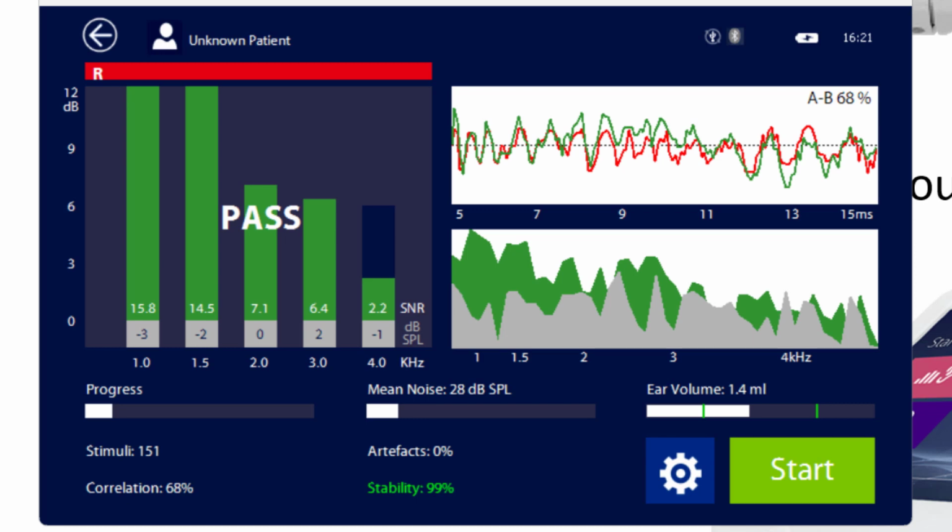Now, what else do we see on the screen? We see 2 lines with a timeline underneath. So it says from roughly 5 to 15 milliseconds. That is the milliseconds of the recording, and that is all the recordings split in 2 buffers displayed on the screen.